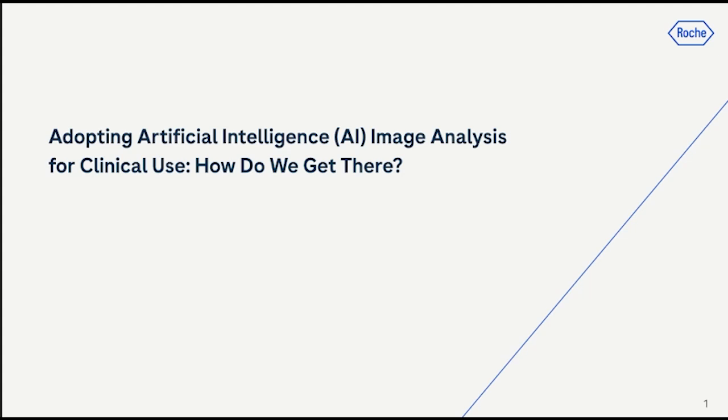Yeah, Sylvia, this is a great question. And I think recently there have been a number of tools that assess, quote, quality of the slide. And that can be anything from pre-analytic, pre-scan quality, to stain quality, to actual scan quality. And I think there's a long way to go with those tools. I would argue that many of those tools are not entirely sufficient. If you're scanning a very fatty piece of tissue, no AI tool will tell you that the scanner did not pick up the fat on the digitized scan.